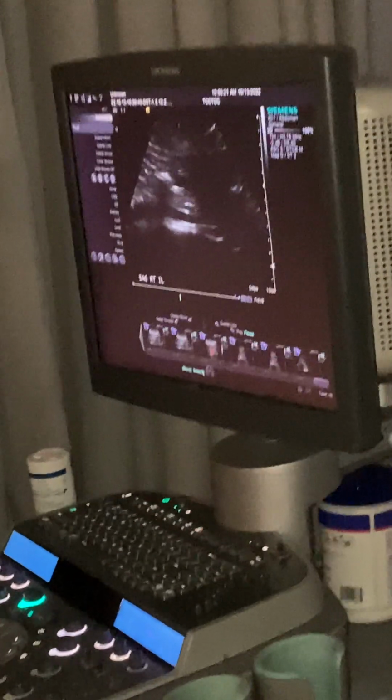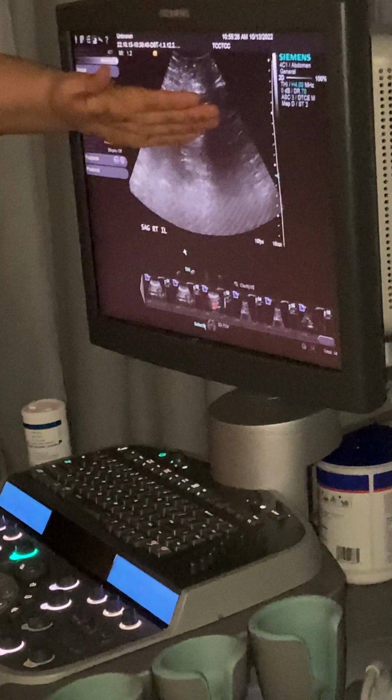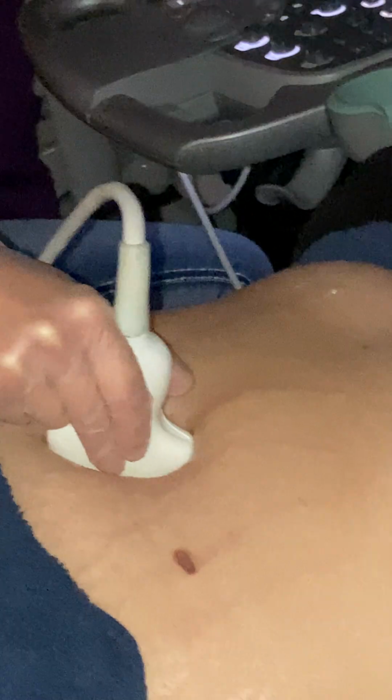And on the picture, we pointed to the left. Left would be higher on the picture. No, not at all. It's just the way hers went. It went higher. It's going to be all about whether I'm angling towards the left side with the bottom of my transducer or angling towards the right side.